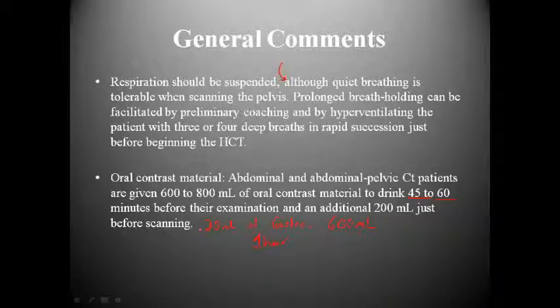Then we do the same protocol again, with the exception of them only drinking 400 milliliters. And then we wait another hour. We bring them down to the scan room, and then they finish off the 200 milliliters. And usually, by this amount of time, usually around 2 hours, the contrast has reached the rectum, or very close to the rectum. I think one of the many things that we kind of get wrong with CT is not allowing the contrast medium to actually get to the rectum. And we kind of overlook this.